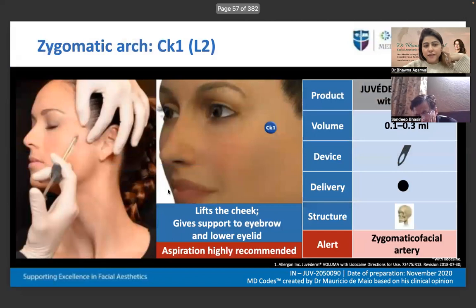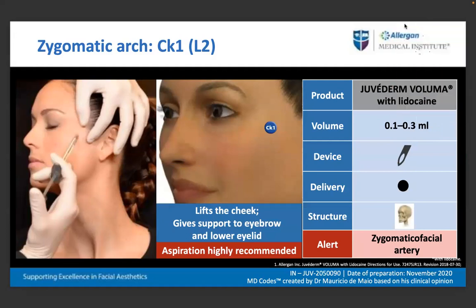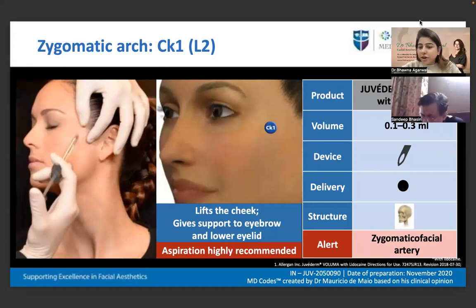So when we talk of CK1, that is the zygomatic arch. The product here we always use is Voluma by default. No other product. It has to be a hard, rigid, and high G prime product. The volume is 0.1 minimum and 0.3 maximum, but it is usually 0.3. 0.1 is per point. So the minimum dose for CK1 is 0.3. The maximum dose is 0.5 in one session.